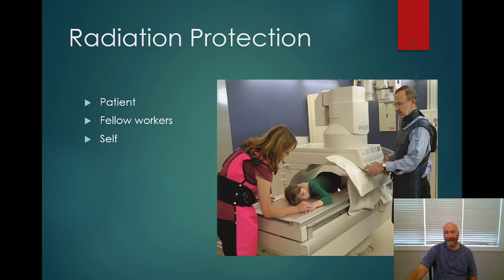So maybe that needs to happen with pediatric patients to keep them from squirming all over the place. But if you get in the habit of doing this with all of your patients, you're taking a radiation dose that you just don't need to be taking. So make sure that you follow the cardinal rules of radiation exposure. Limiting radiation exposure for the patient is to keep the dose as low as reasonably achievable. We'll refer to that as ALARA, but make sure that you also take care of yourself, and your dose reduction is time, distance, and shielding.